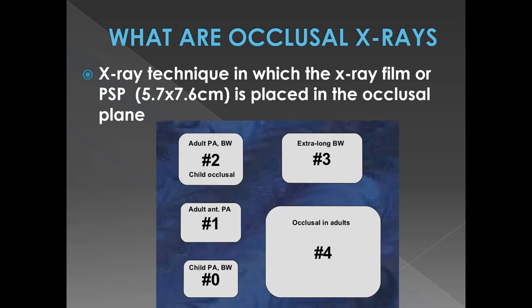The PSP is sort of a hard film, like the normal X-ray that you're seeing in front of you, but it is an X-ray that you can reuse, maybe a few hundred or a few thousand times.